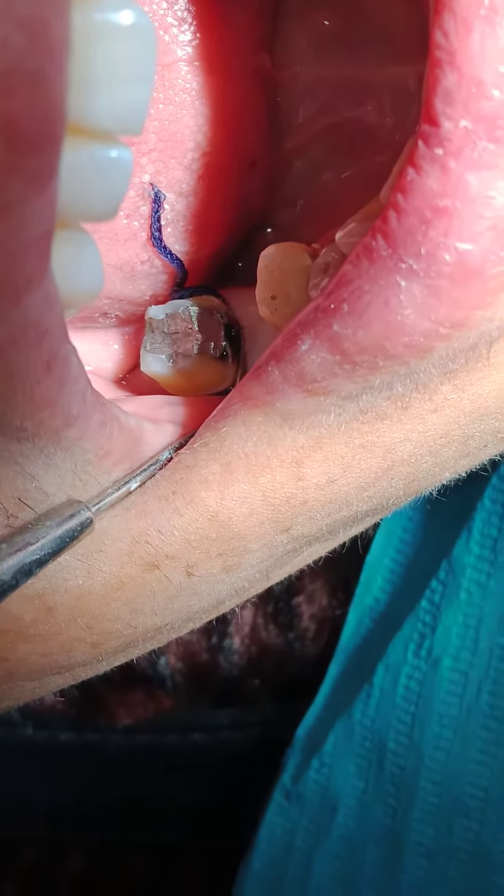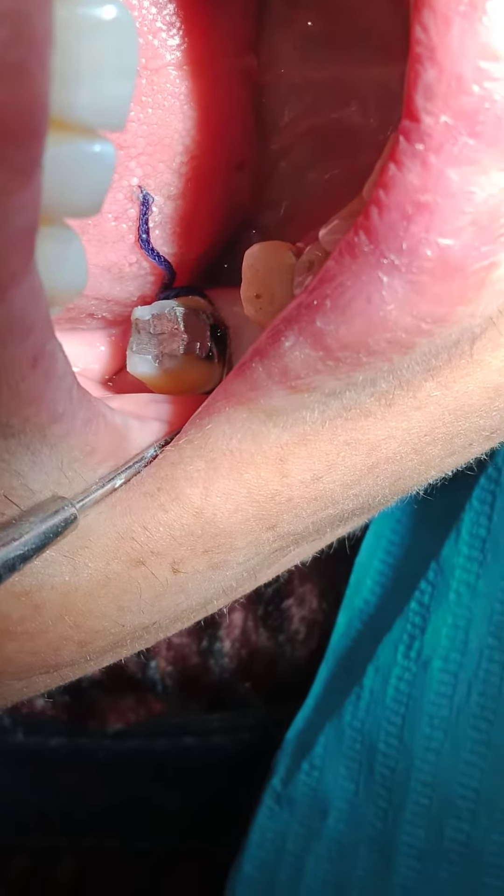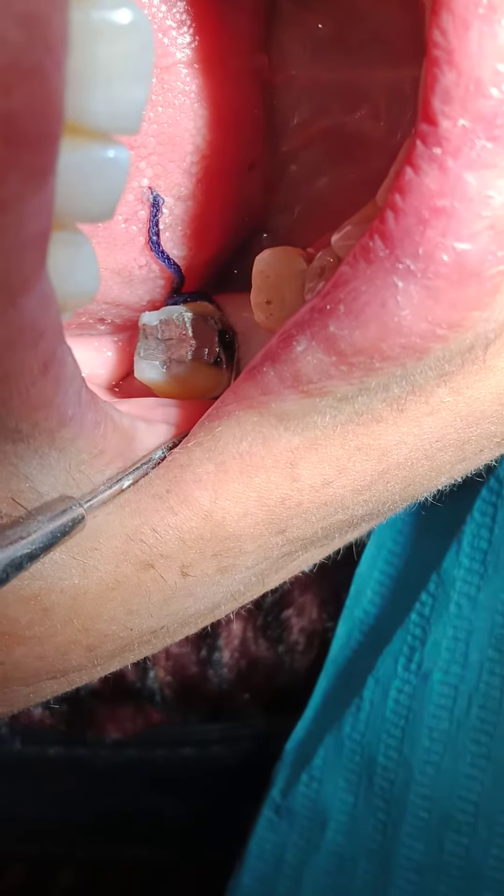The second function of this retraction cord is that if there are crevicular fluids and so on, they come out without obscuring the area that you're working in.